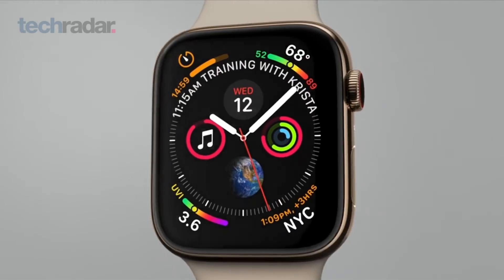This means you can get better cellular reception, and of course, like with the old watches, that's where it takes your heart rate.